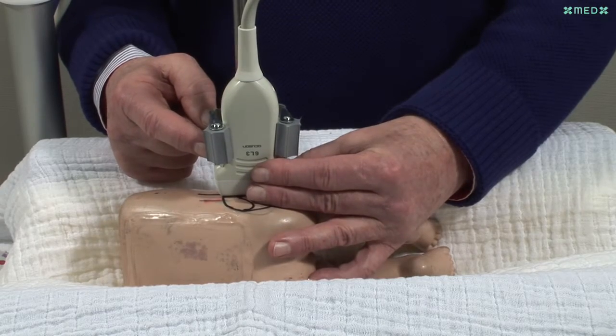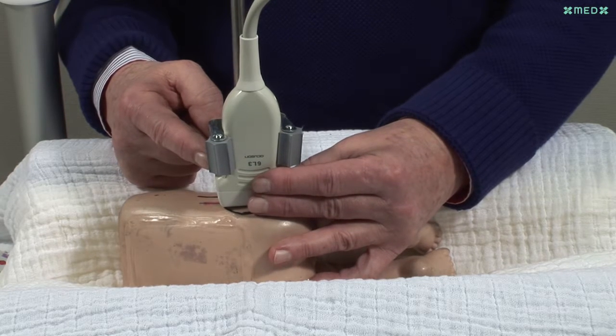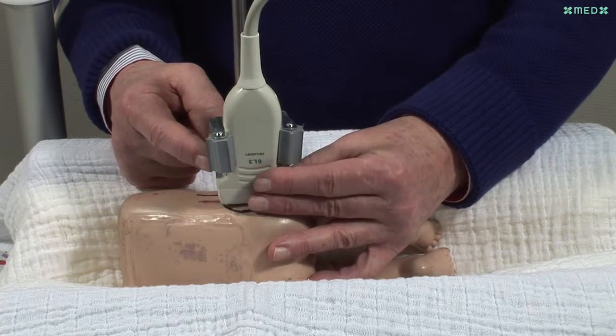The correct position is demonstrated here. The transducer is held with the left hand and moved across the hip joint — forward and backwards repeatedly — locating the hip joint.